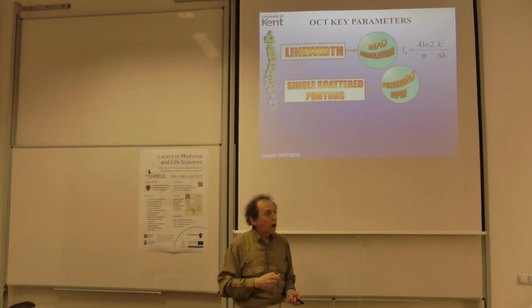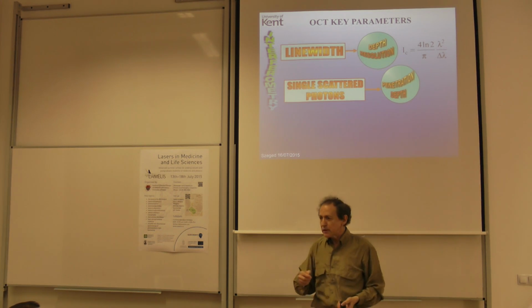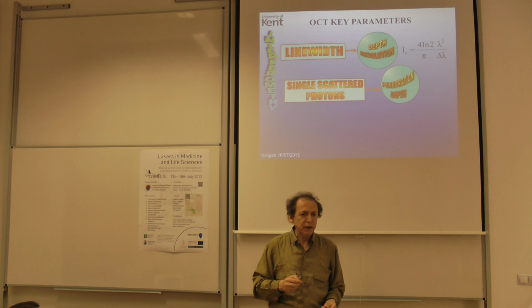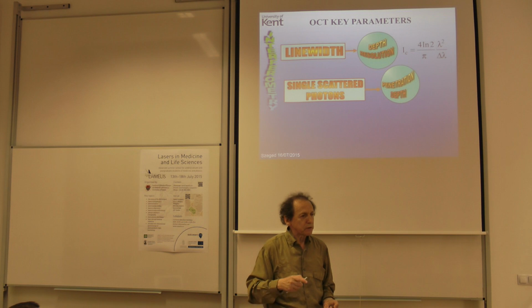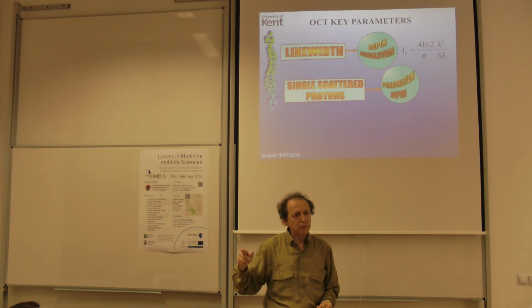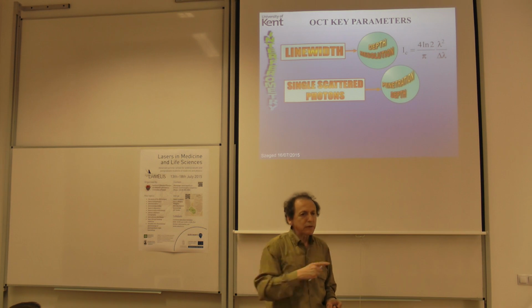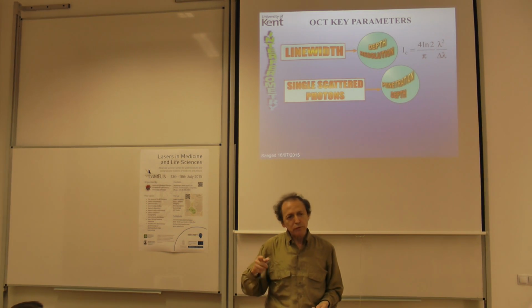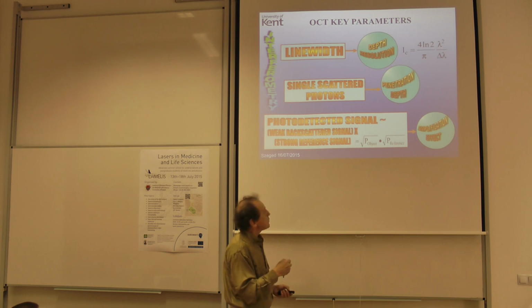However, if you take a piece of fiber and build a confocal microscope and use it for skin, and there is a company making that, you can Google Lucid in Boston, they quote 350 micrometer penetration in skin. Now, on the same system, add the reference beam, build an OCT, and you will achieve 1.5 millimeters.